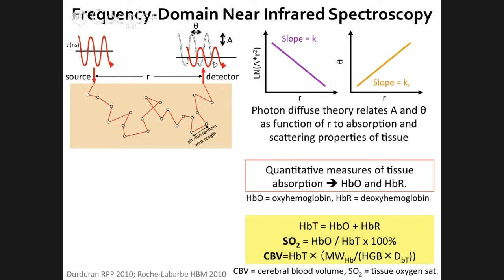The areas where there's no cortex. Yeah. Right. Certainly, and even with neonates, their skull is so much thinner, so it's a huge advantage, yeah.